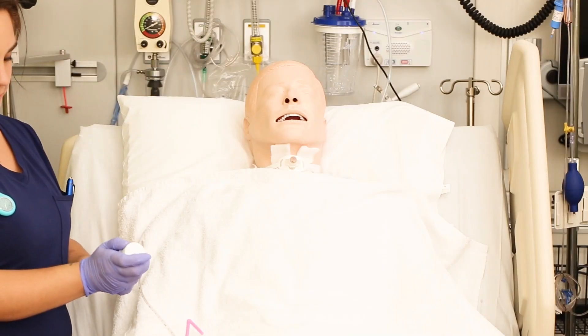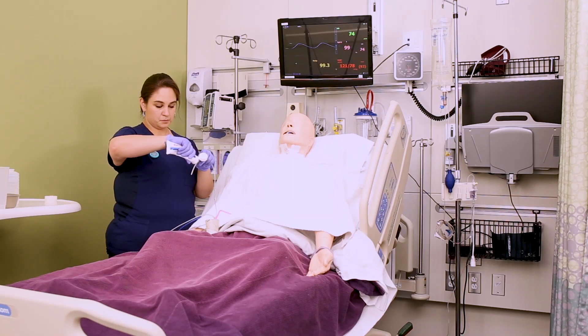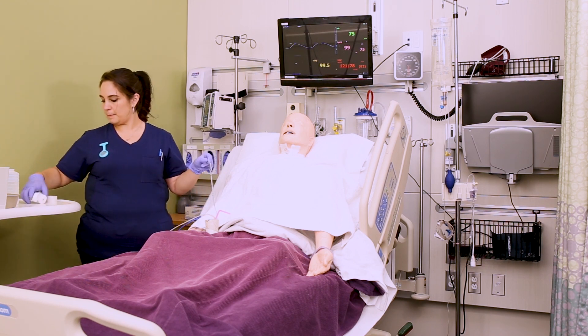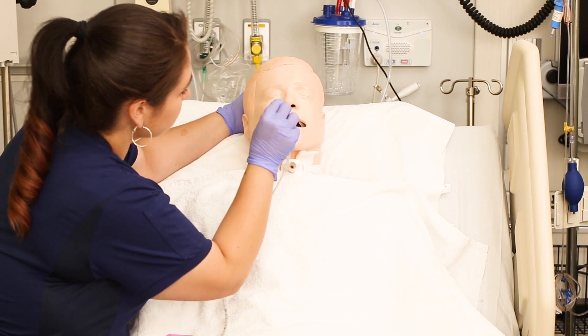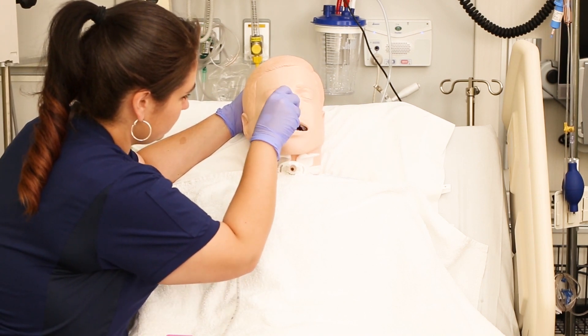Now you want to lubricate the end of the NG tube and then slowly begin inserting the tube. Let the patient know what's going on. Have them sit straight up and tilt their chin to their chest. You want to insert the tube straight back and down, not up.